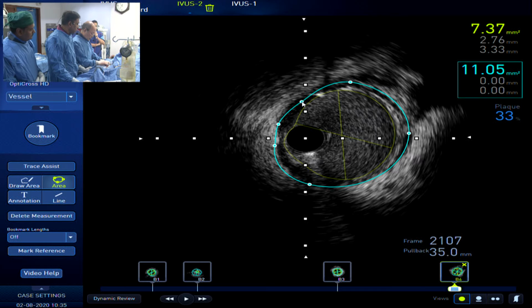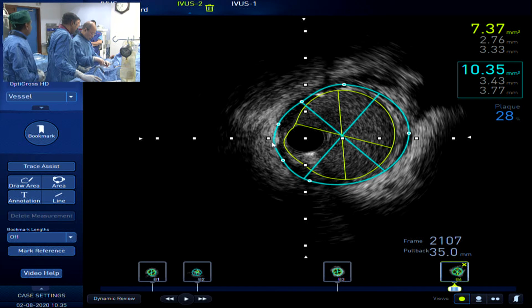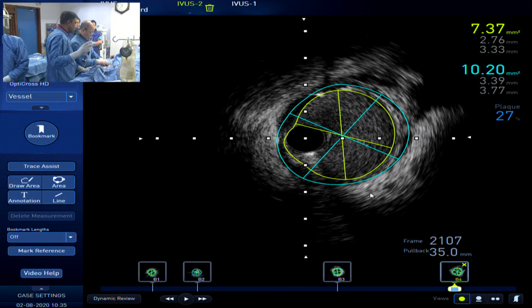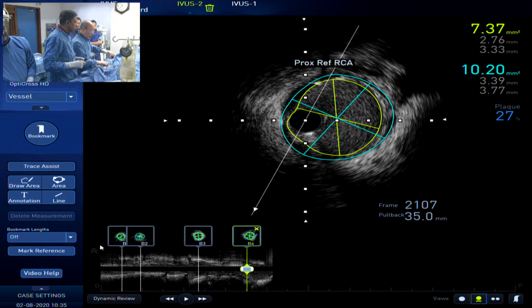Malcolm, have you? I don't. The reason I asked is, fortunately, I do very few of these very complex CTOs, so I don't have a very high rate of perforation. But I've seen some cases where we were doing intravascular ultrasound, and in retrospect, you could actually see the effusion beyond the vessel. In one particular case, we didn't recognize that the patient actually had a large effusion, but it was first recognized from the intravascular ultrasound.